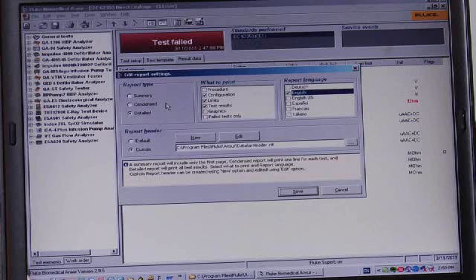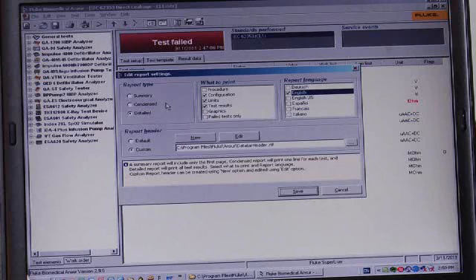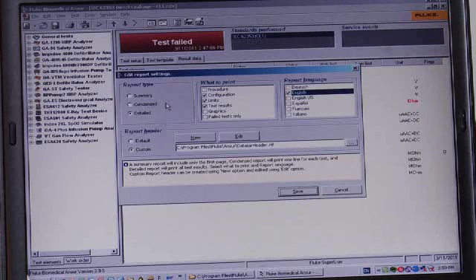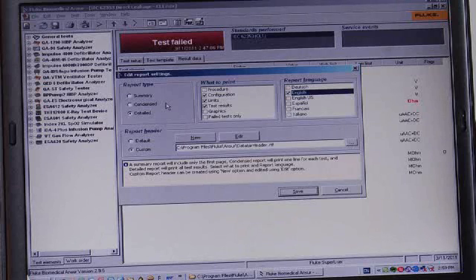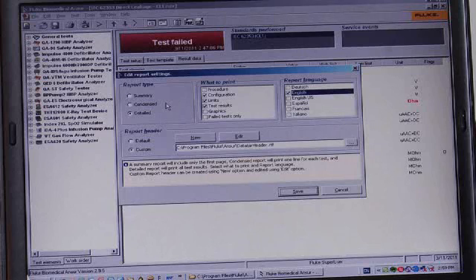So if we pick the detailed test type, which you see has been selected in the screen, then we can go to the what to print section, which lets us select the things that we want included in this test report.